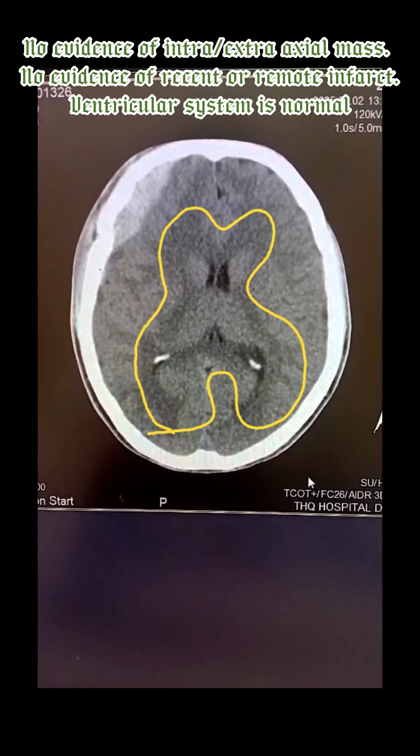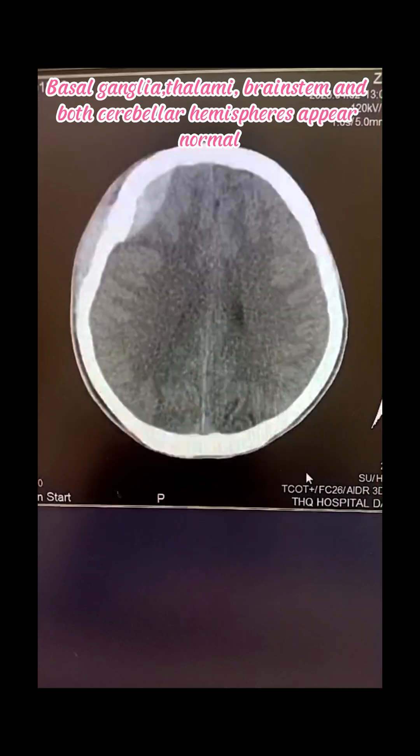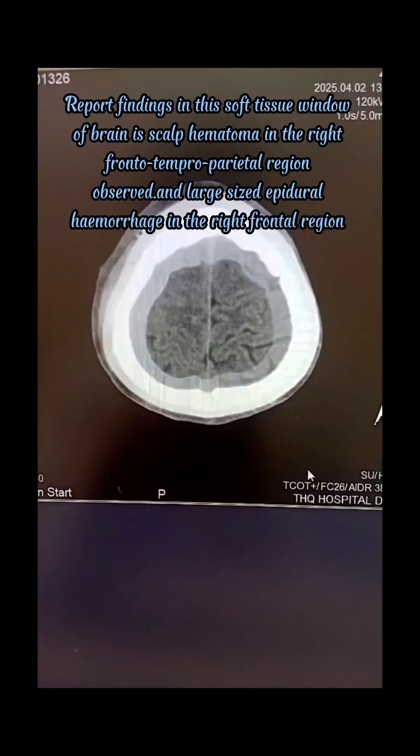No evidence of recent or remote infarct. The ventricular system is normal. Basal ganglia, thalami, brainstem, and both cerebellar hemispheres appear normal.